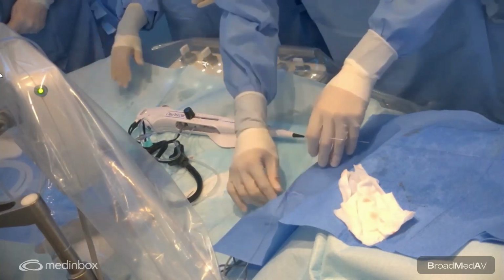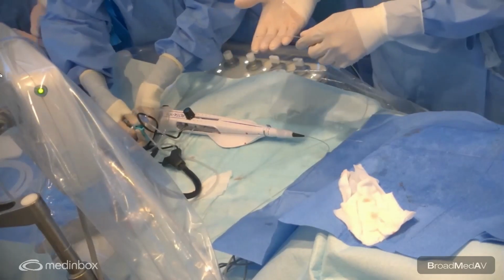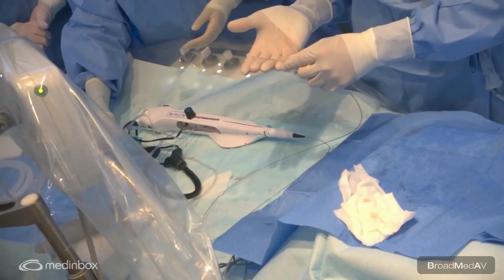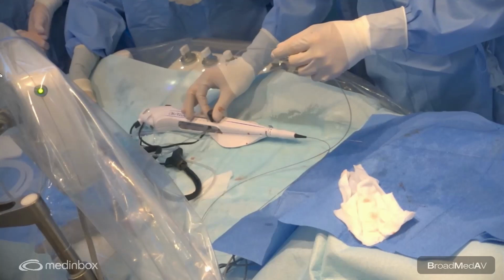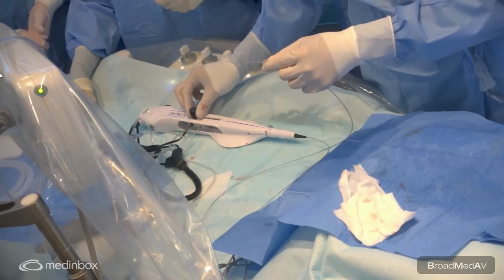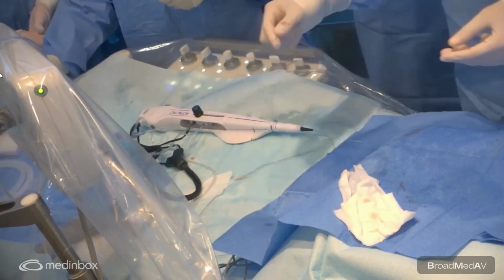Now you put on your flush. And once you get the drip, you make sure the burr advances. There you go, drip is on. So then you test it, it's advancing very well. That means there's no kink in the system. Then you lock it like before at the second marker. Turn off the Dynaglide and let's put it on.